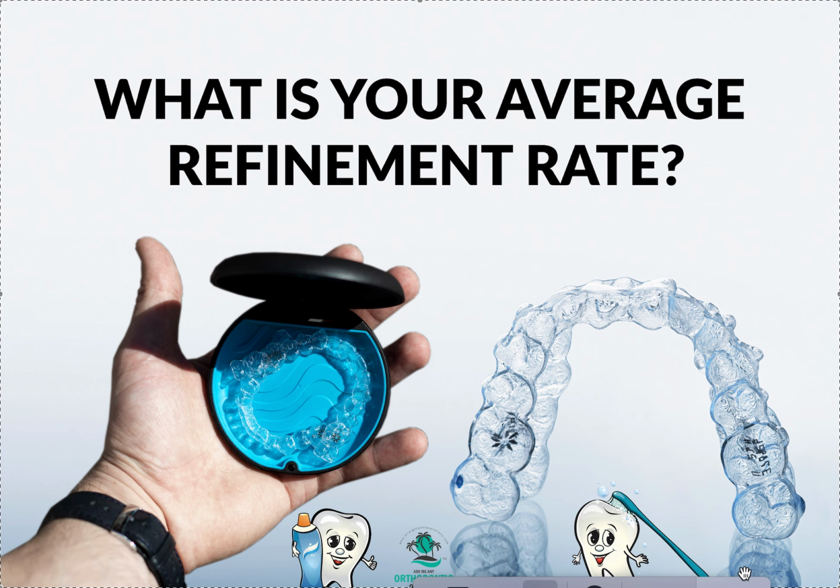Now, what's a normal refinement rate for an orthodontist versus a general dentist? Well, it should be the same, and it really should be 0. Certainly no orthodontist is going to have 0. We're going to probably have 10, 20, maybe 30% max. But most general dentists that I've checked out have more like 70, 80, 90, 100%. And that's way, way too high. A refinement for Invisalign is like a bracket repositioning for braces. You shouldn't have them. If you have them, you did something wrong.